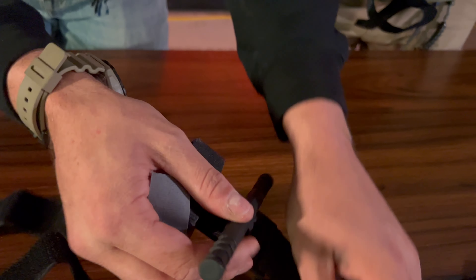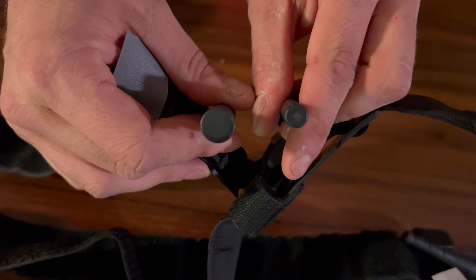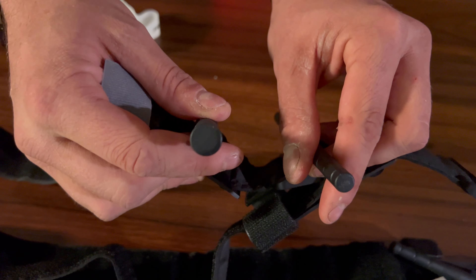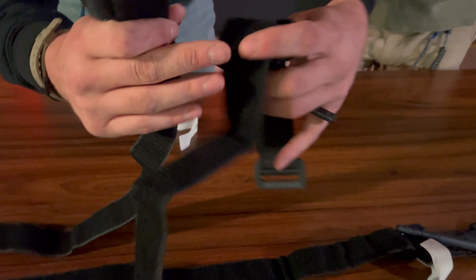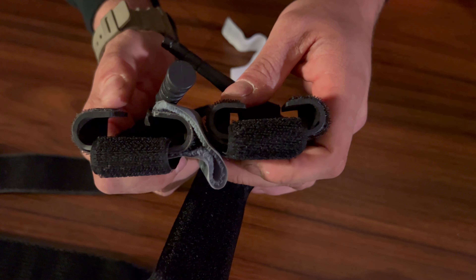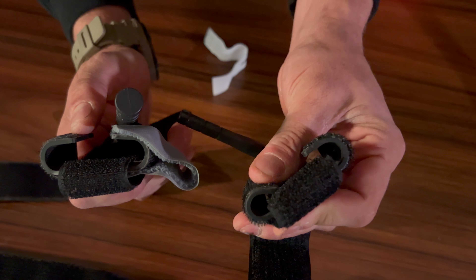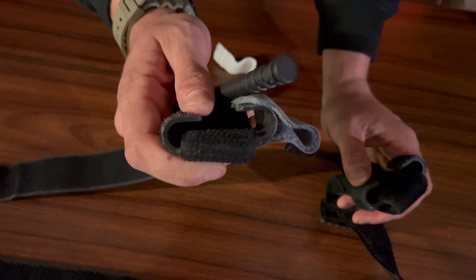Looking at the windlass, you can see the notches and the plastic — this is a reinforced windlass. The circumference and size is completely different between the genuine and the fake. When you're wrenching down, you want to be using that bigger windlass.